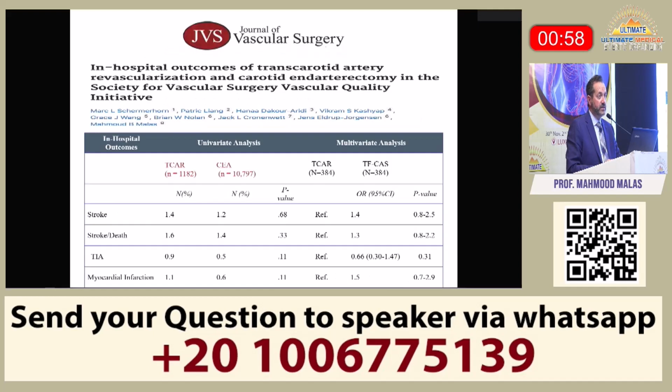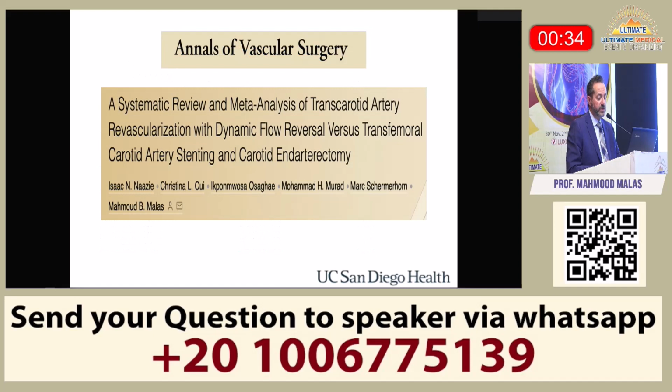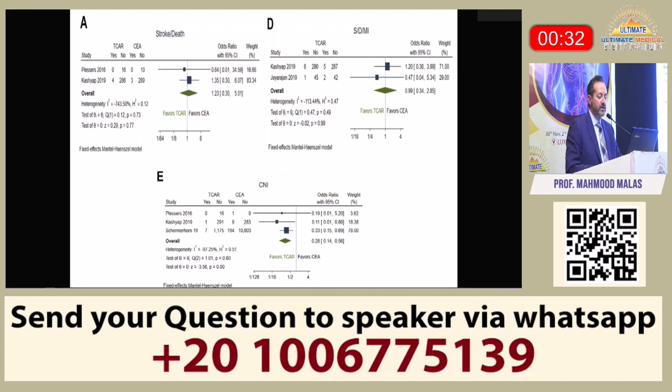And this is the first study that has ever been done comparing TCAR to CEA. At that time, it was only about 400 patients. There was no difference in the risk of stroke or death with TCAR compared to CEA. And then when we had a lot more patients, almost 3,800 pairs, propensity score matched, no difference in stroke, no difference in death between TCAR and CEA, but there was a significant reduction in the risk of cranial nerve injury and a little bit of reduction in MI.